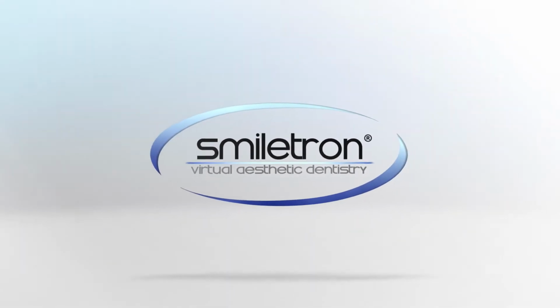And it is for them that we designed SmileTron.